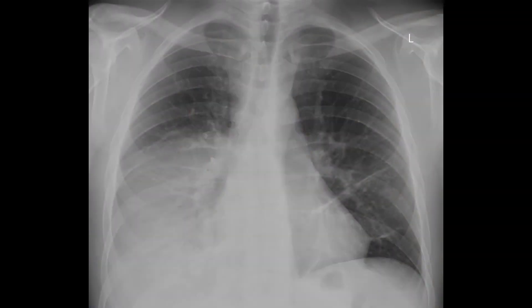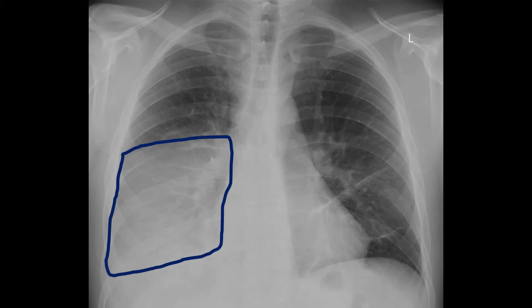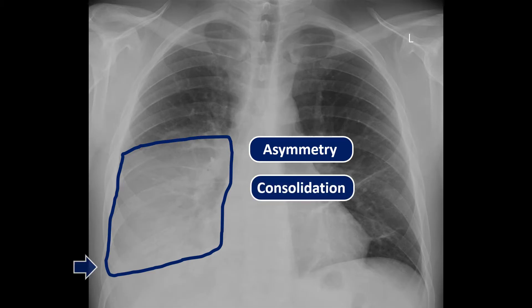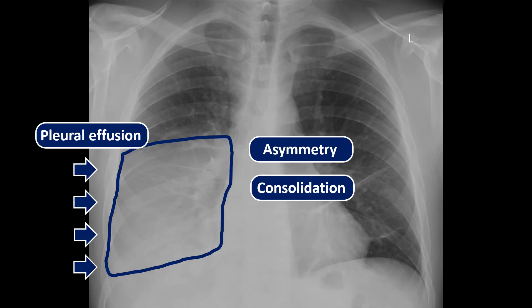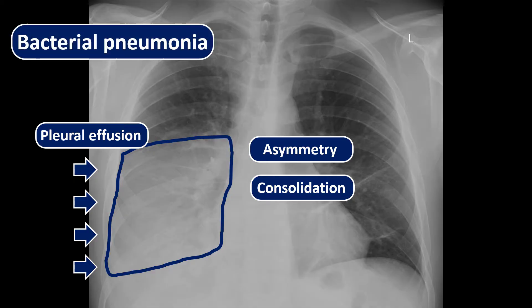Now imagine the same patient with the same story, only we find this on chest x-ray. As opposed to subtle, bilateral, symmetrical infiltrates, you see a marked asymmetry and a thicker, more dense infiltrate, which is a sign of consolidation. There is also pleural effusion. This looks like bacterial pneumonia.